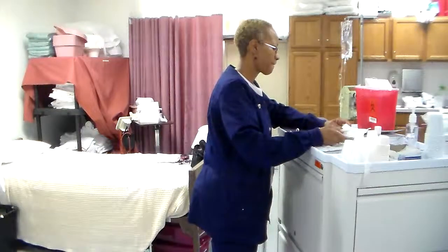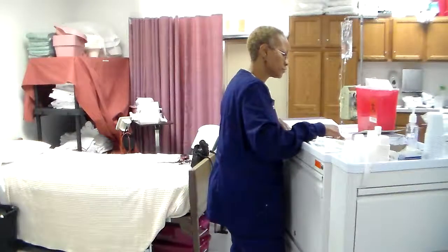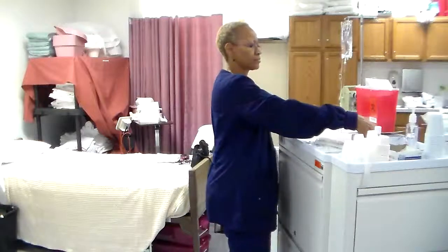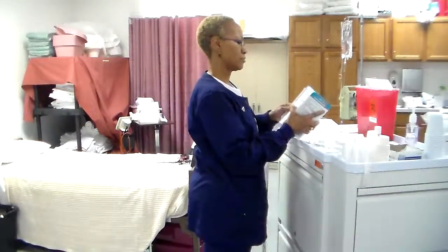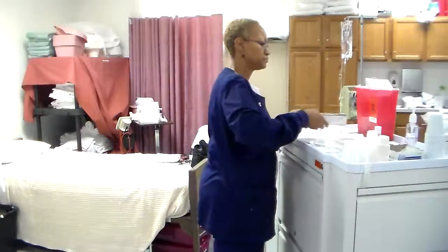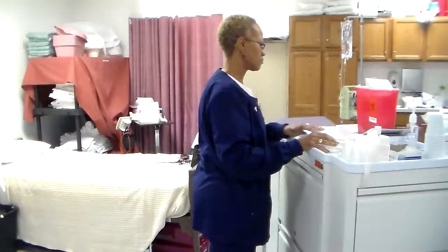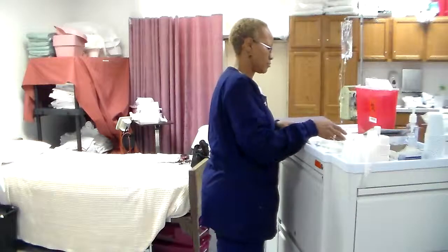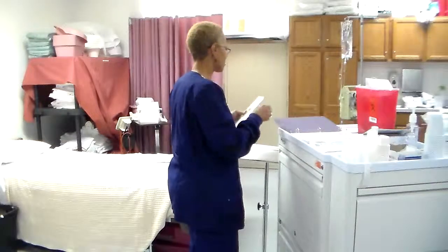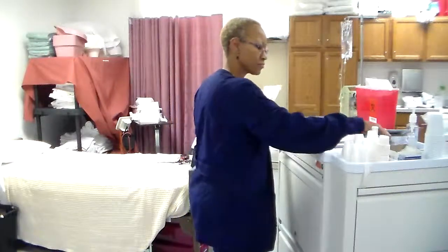Determine client's medical history. Collect information necessary to administer medication safely, including action, purpose, side effects, normal dose, time of peak onset, and nursing implications. Assess compatibility of drug with existing intravenous IV solution. Assess patency of client's existing IV infusion line by noting infusion rate of main IV line. Assess client's history of medication allergies.